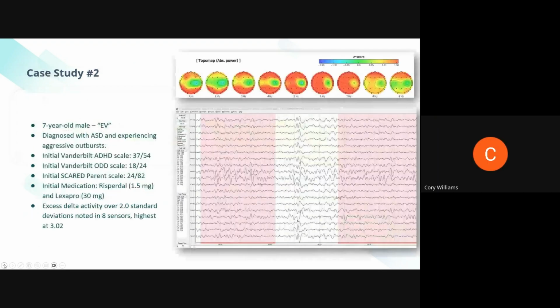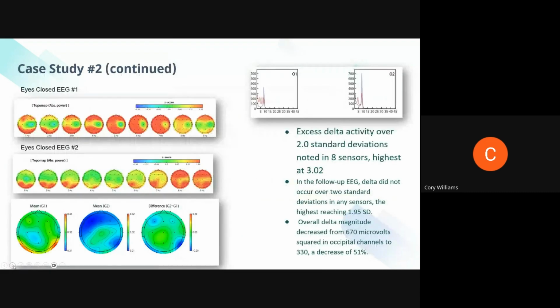Yeah, absolutely. And just to point out, in case you missed it, here in the EEG, this is where we see one of those big spike and wave discharges, right? And when we see those in the EEG, that's when we want to start thinking about anti-seizure medications. Here we can see, and this one's a little bit more clear in the pre and post maps, look at how much slow activity we saw in map number 1 compared to what we saw in map number 2. Right? He's still having those discharges, but it is significantly less. We see far less slow activity.